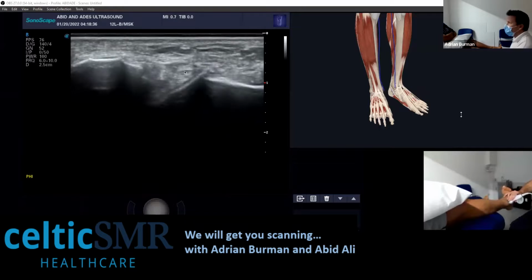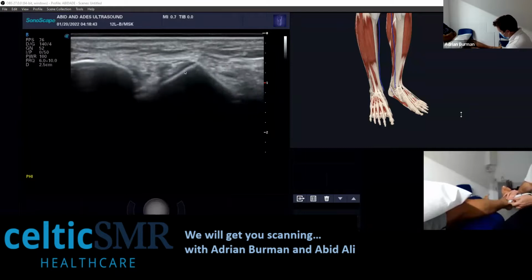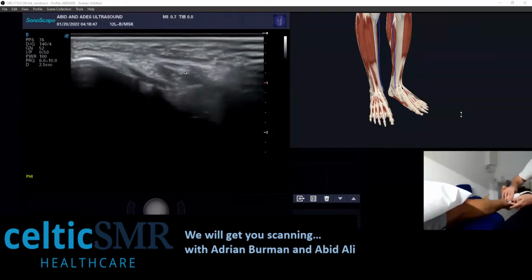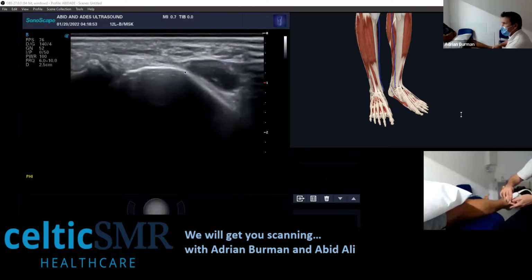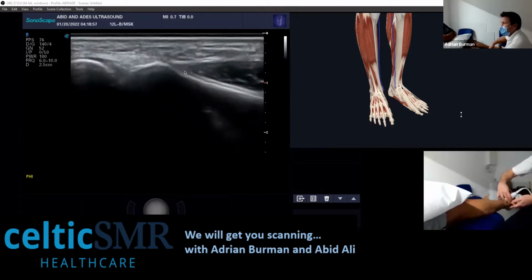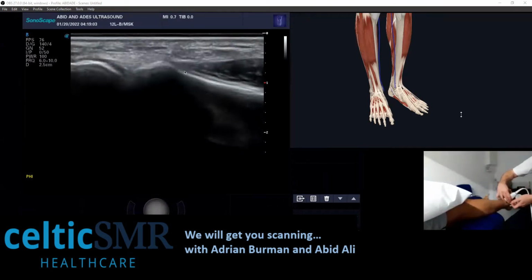Now from this position, you keep the top of the probe on the fibula. Okay. Now I'm going to put my finger here just to keep it steady. And you rotate until that peak's gone, and the next peak comes. And this is your AITFL. And that might be the inferior one. It might be the superior one there. There's a bit of an angle to the AITFL.